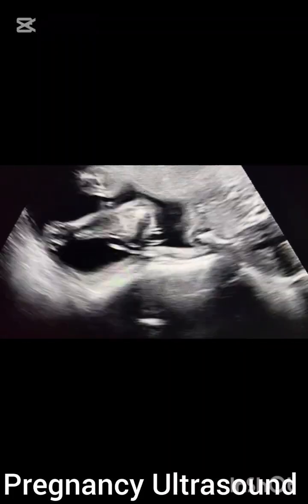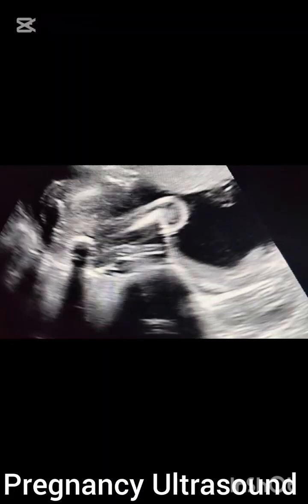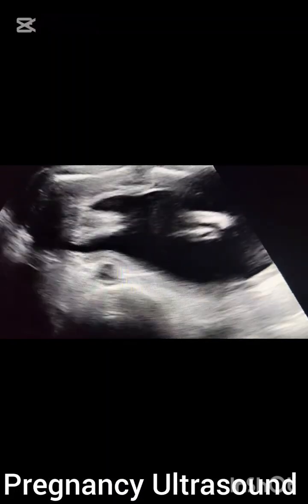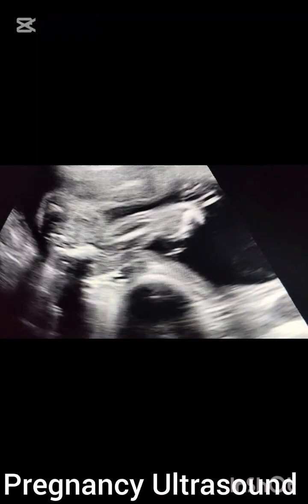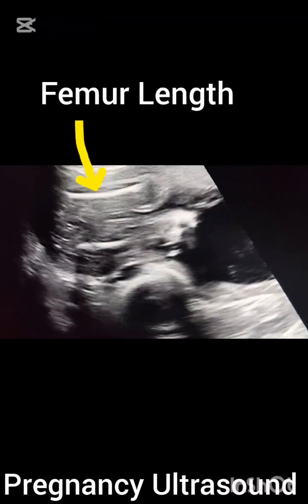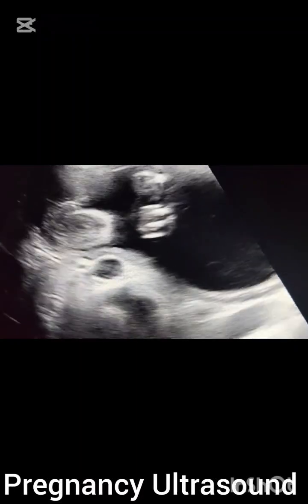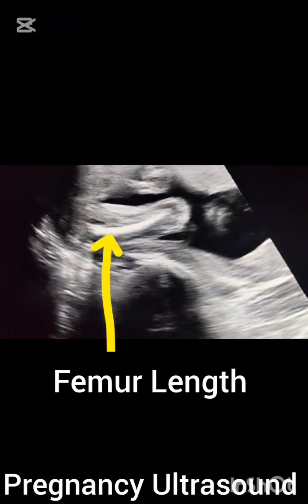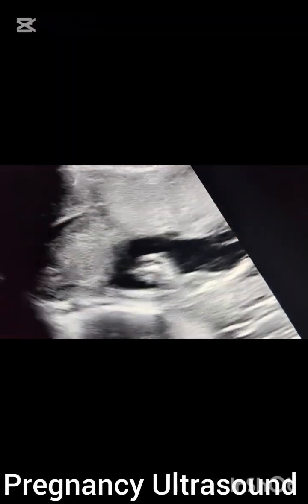...should not be in the frame. The third parameter in fetal biometry is femur length. We are measuring both femurs — the longest single bone is the femur. This is the femur length, third parameter in fetal biometry.